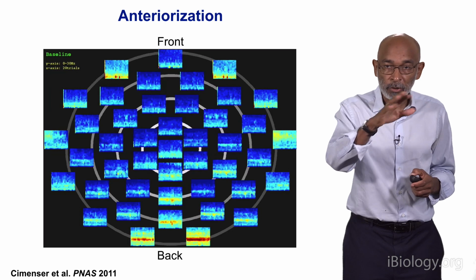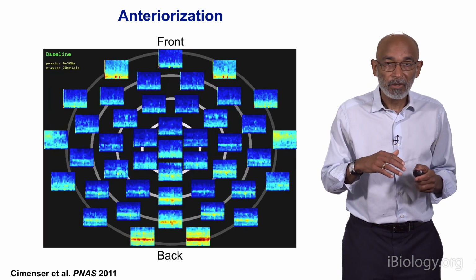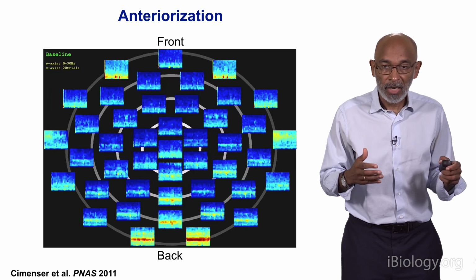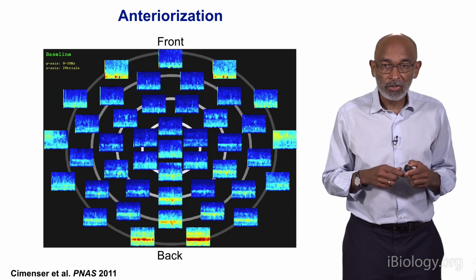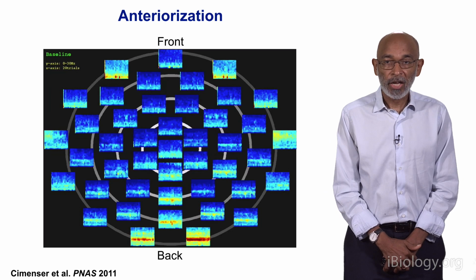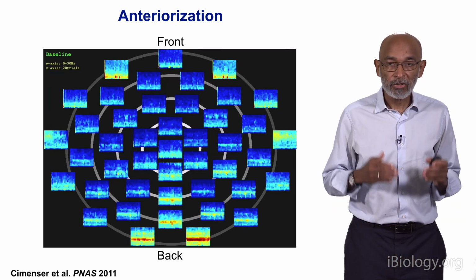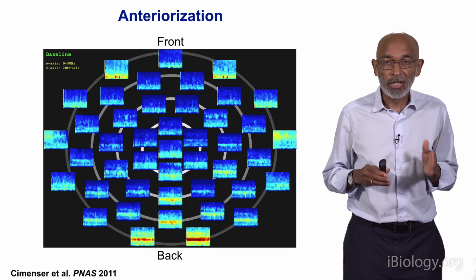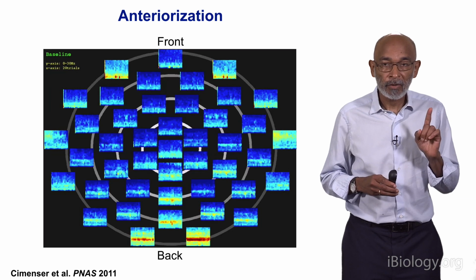So if you see, most of it's blue, meaning he has oscillations going on, but the amplitude is not that high. But look at the back, look at the bottom of the slide there. You see he has those 2 red strips? So those 2 red strips are his eyes closed alpha oscillation. Remember, as I said, he's lying there like this with his eyes closed, and he's producing this very, very regular 10 hertz oscillation. All right, now, so that's the neuroscience piece.